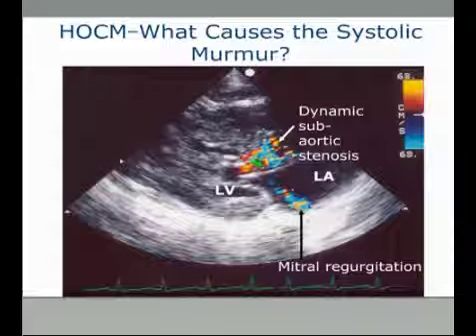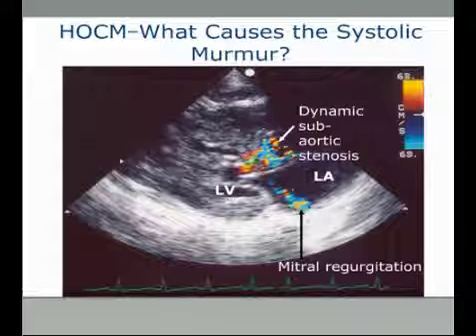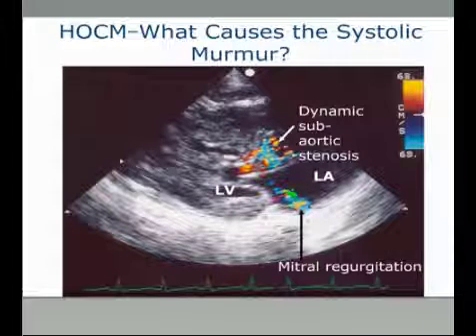So here in the outflow tract, we have color flow evidence of dynamic subaortic stenosis, and here we have a little jet of mitral regurgitation coming into the left atrium.